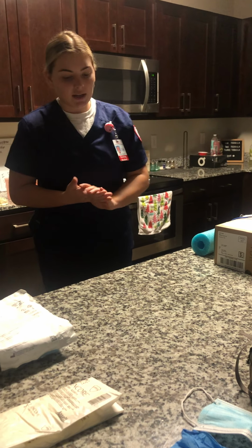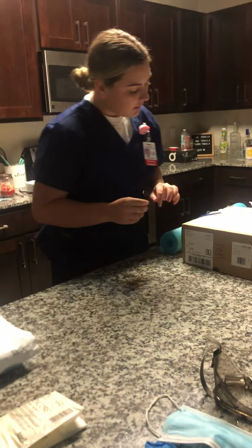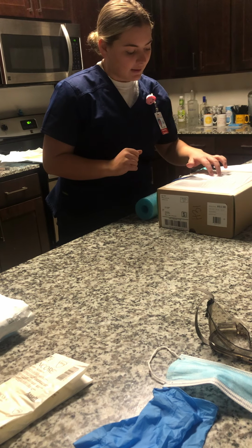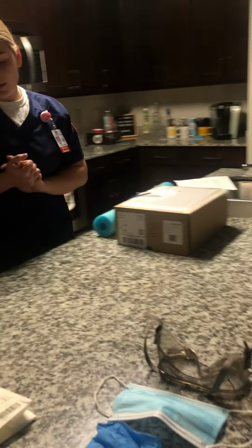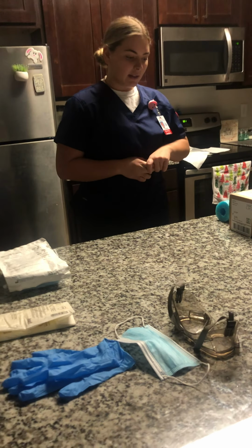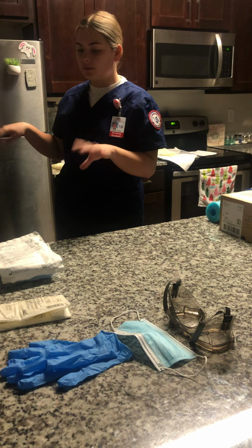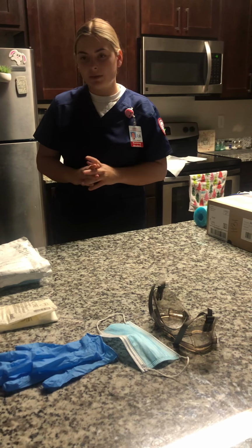I'm going to perform hand hygiene, and I'm going to look at his catheter insertion site. I'm lightly palpating, so that does seem good. So now that I've done that, I'm going to gather my supplies. I do want to note that the bedside table is waist level. So this is my bedside table, and it should be waist level.